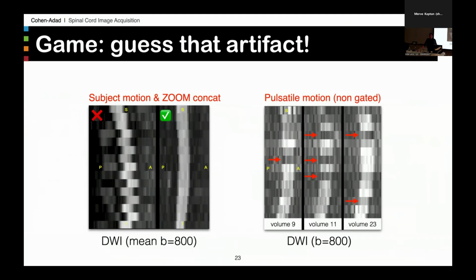Yes? Julien, is the gating protocol always the standard setup for spinal cord motion? The spine generic one is gated, I believe. Yeah, but is the gating optimized for spinal cord? I don't know how it works necessarily. Well, it's basically cardiac dependent. Yeah, but there are also a couple of papers where we ask the question.